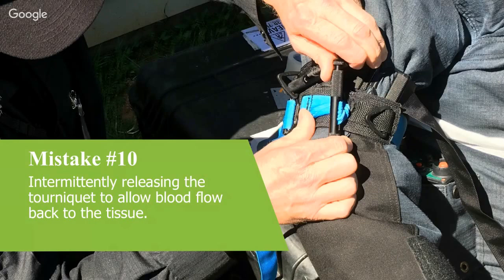You manage the pain within your protocols and within what's appropriate for the casualty's overall state. You give them pain relief if it's available to you. If it's not, you just stick to your guns, leave that tourniquet on, reassure the casualty that it's required, it's life-saving, and get them to a surgical facility as soon as you can. They won't thank you at the time, but it's life-saving. It's a better option than trying to be kind, loosening it off to ease the pain, and have it fail and they bleed out and have a bad outcome.